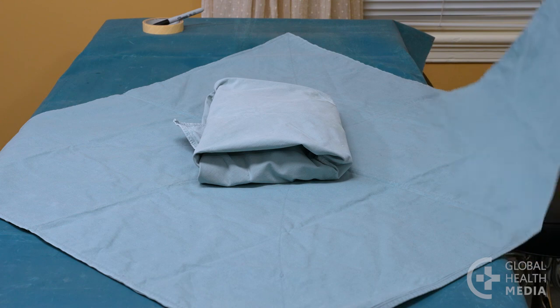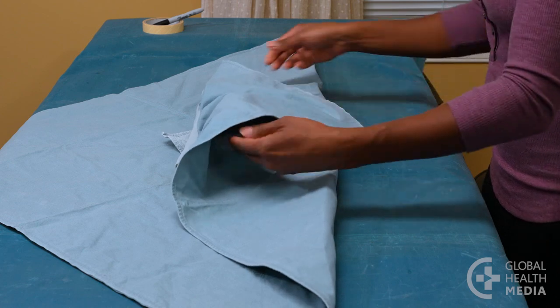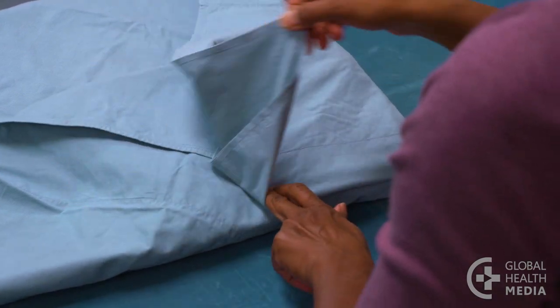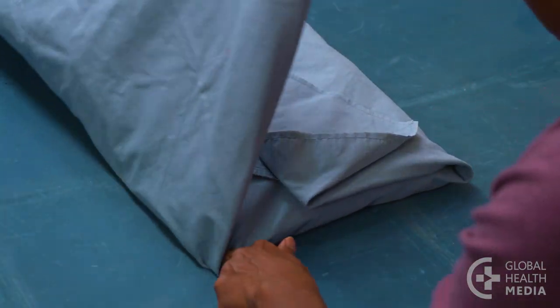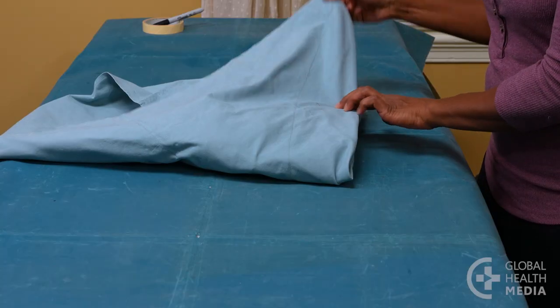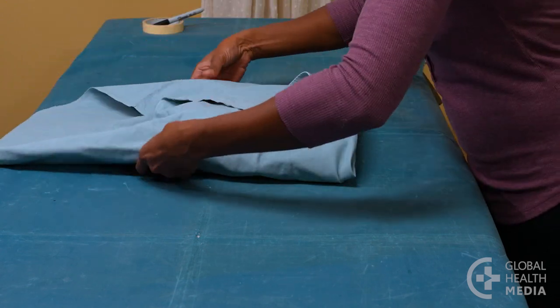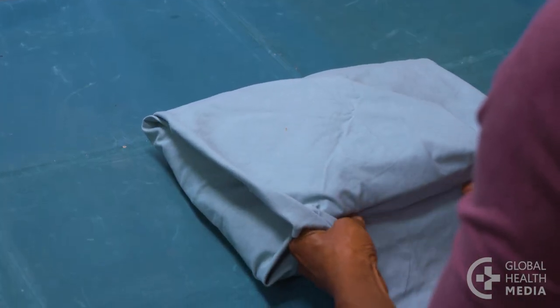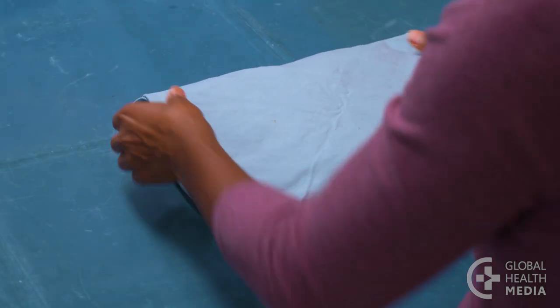Bring up the lower corner to cover the package and fold the tip back to form a tab. Fold the right corner over the package and fold the tip back. Then fold the left corner over the right fold and fold the tip back. Bring the top corner down over the package and tuck the corner under the right and left folds, leaving a small tab visible for easy opening.